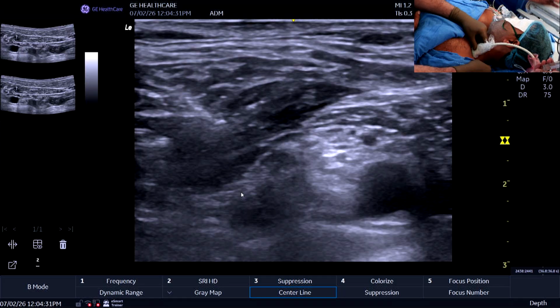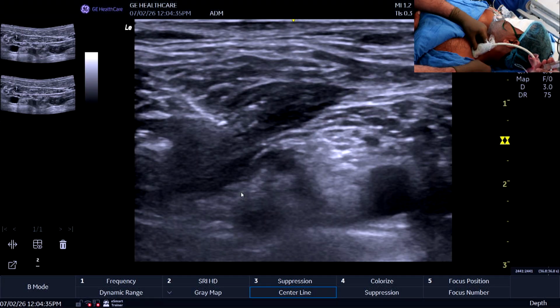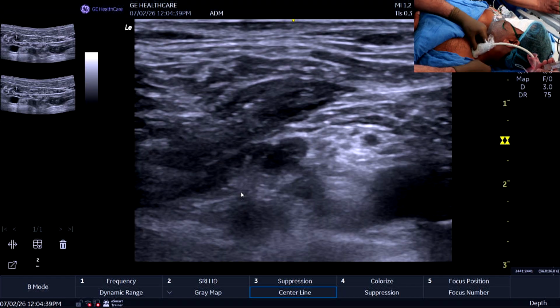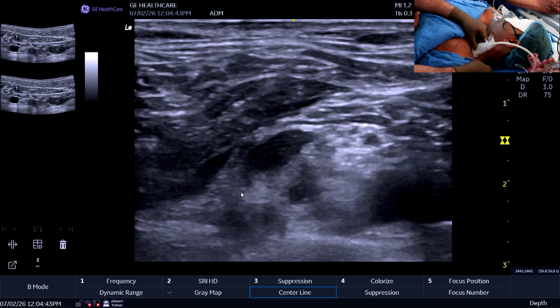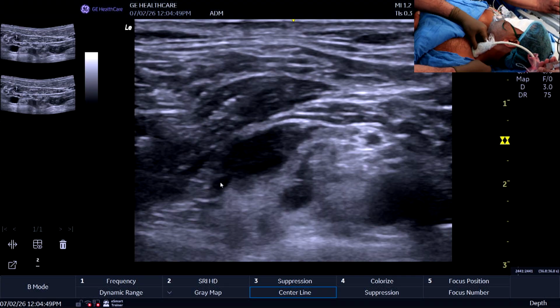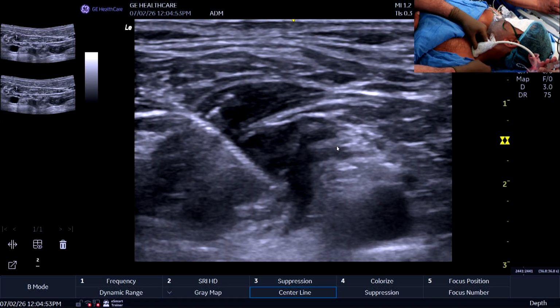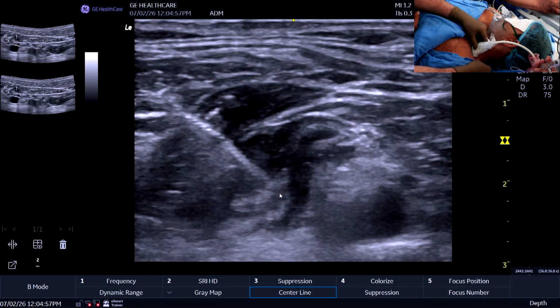You can see the brachial plexus elements being now separated. You can see the supraclavicular nerve, suprascapular nerve, which you can see now is engulfed with local anesthetic. As the drug spreads, Neeta injects, the drug spreads more towards the posterior and the anterior divisions. So the entire brachial plexus here at the level of the superior trunk is engulfed. This is the needle tip. She has given just hardly 5 ml of local.